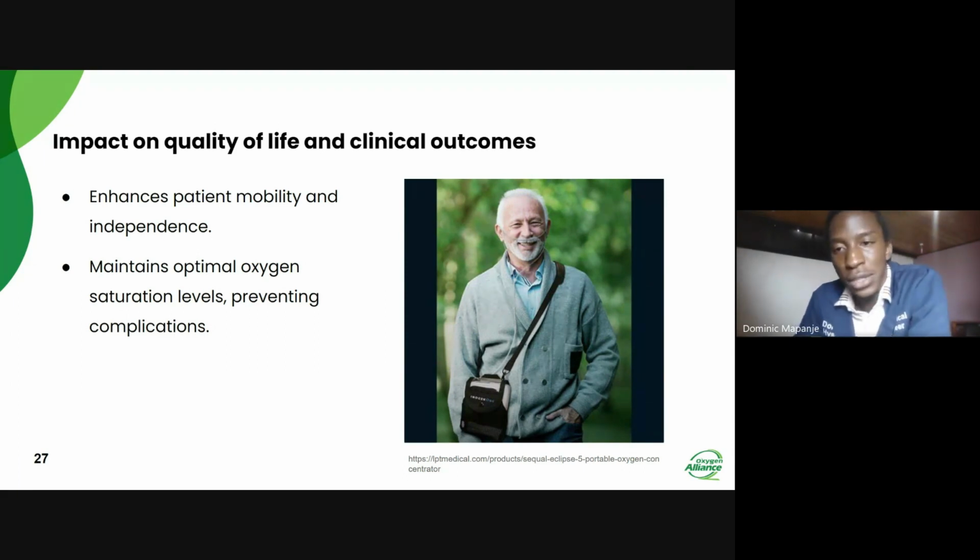On clinical outcomes, these devices deliver effectively. They can deliver and maintain optimal oxygen saturation levels in the blood, no less than continuous oxygen delivery methods. But it should be said that, as I have already mentioned, there are cases where you need the continuous flow oxygen delivery method, and there are other conditions where it is convenient to use these pulse-dose oxygen concentrators.